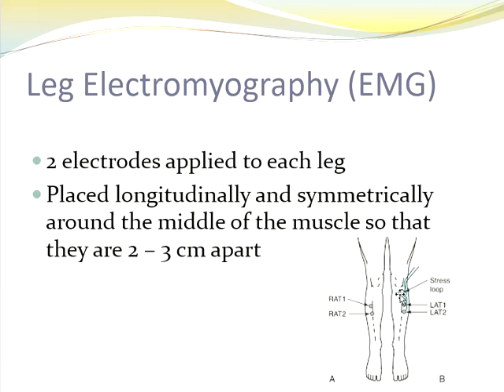So with these electrodes, the stress loop, I've never done it. I find that I just make sure they have enough slack that it doesn't cause tension on the wires, but just not enough that they can trip on it. You know, make sure it's not so low that the patient can trip on it, because that would be a safety hazard.